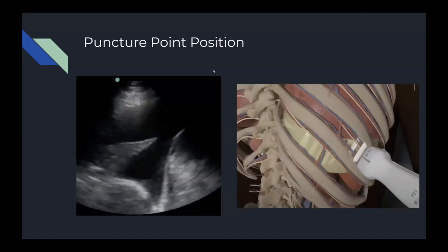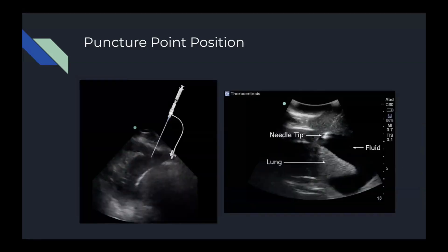To locate the correct puncture point in each patient, you first place the phased array probe in a long-axis orientation at the 8th or 9th intercostal space on the posterior axillary line, with the marker oriented toward the patient's head. The needle should be positioned in the center of the phased array probe to avoid the nerve and vascular bundle that lies on the inferior side of the rib. On the ultrasound image using the dynamic thoracentesis technique, you can see the needle tip inserted into the pleural space as a hyperechoic shiny white dot, with the lungs, liver, and diaphragm visible around it.